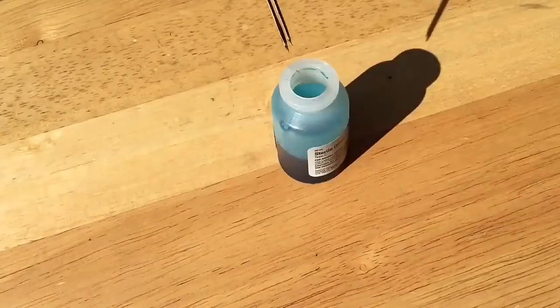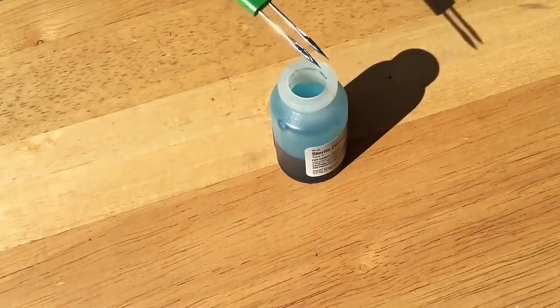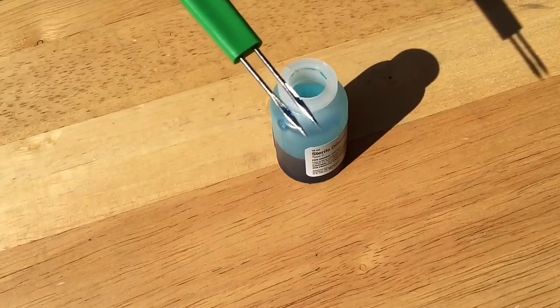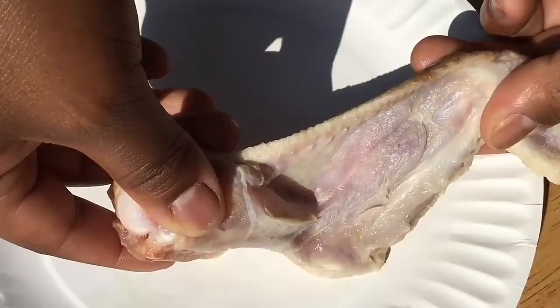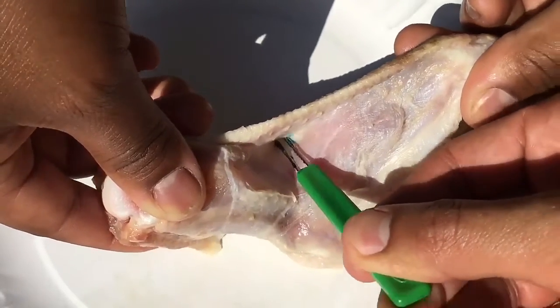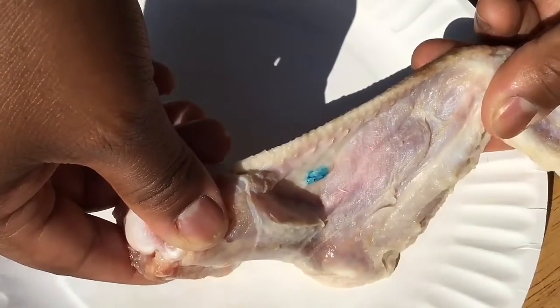When you dip the applicator stick into the vaccine bottle and pull it out, you'll see that the grooves are filled with the vaccine. The blue dye left behind on the skin surface allows you to see which of your chickens have already been vaccinated.